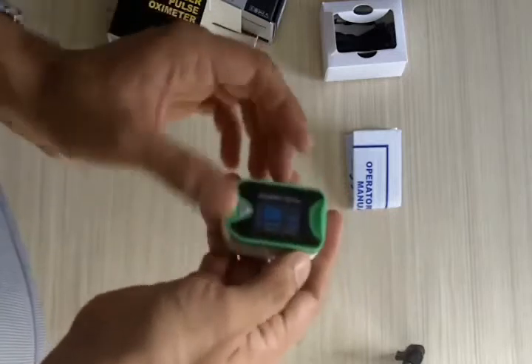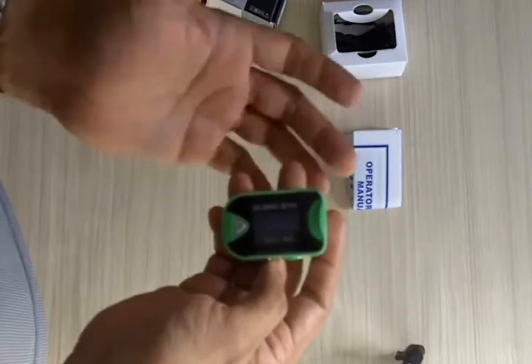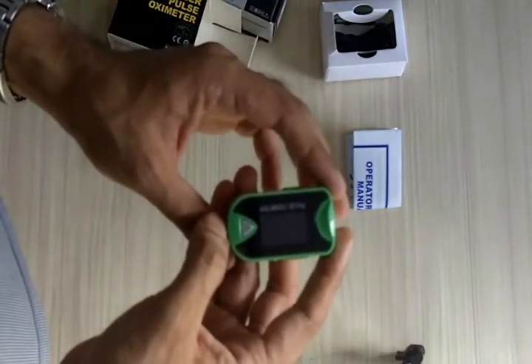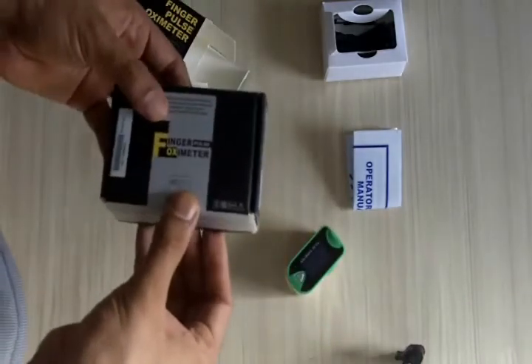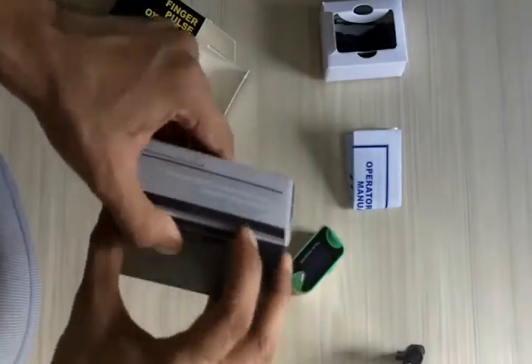Alternatively, you can just take your finger out and after some time it will automatically shut off. The key thing about this model is that it does not have any audio alarm or audio function, whereas its sibling, the MD 300 C3A, does have audio alarm features.